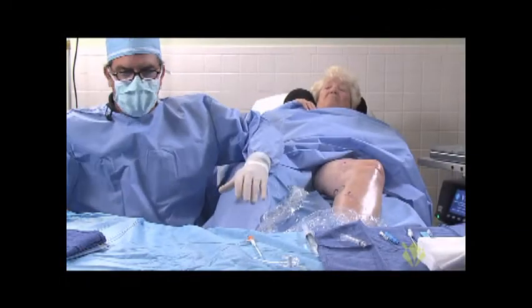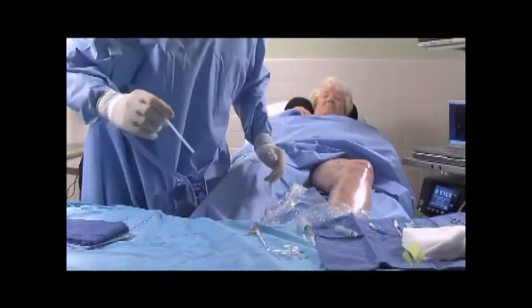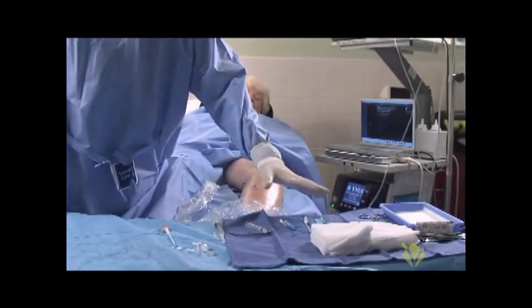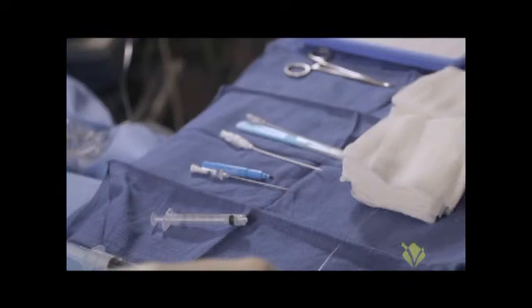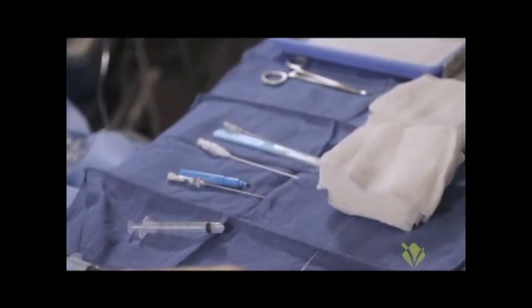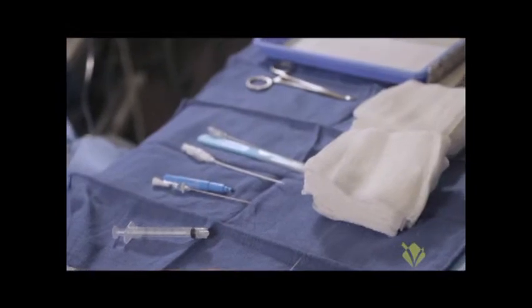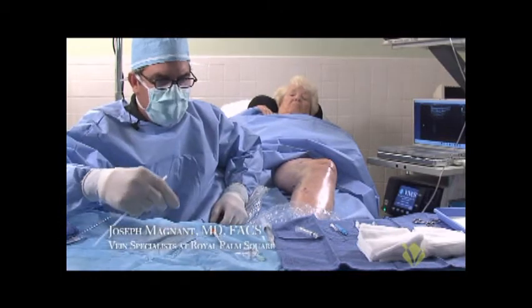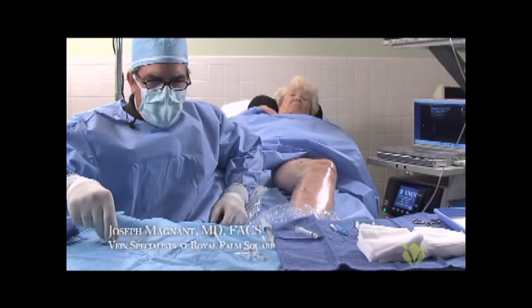This is our basic setup for an endo-venous closure case, whether it's laser or radio frequency. We have a single pack that we've developed that has all the necessary items, but no fat. The basic 4x4s, micropuncture wires — we actually have two kits on the table just to show you the difference.